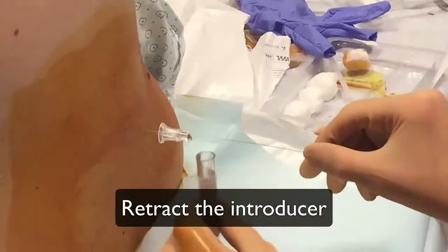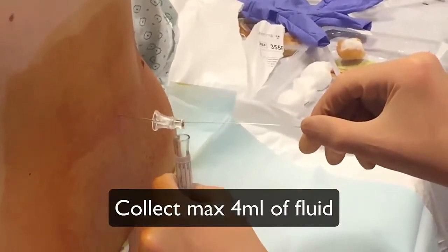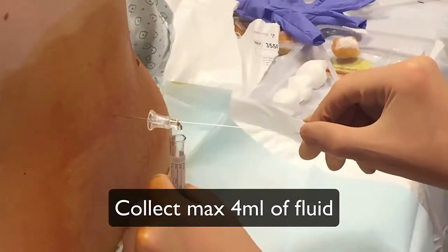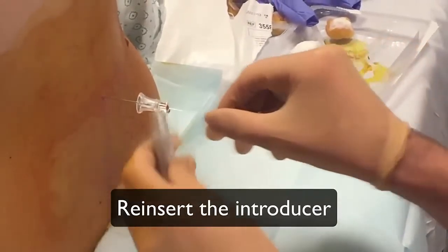Collect the fluid in the recipient. Do not collect more than 4 milliliters of fluid to prevent headaches. Replace the introducer before removing the needle.